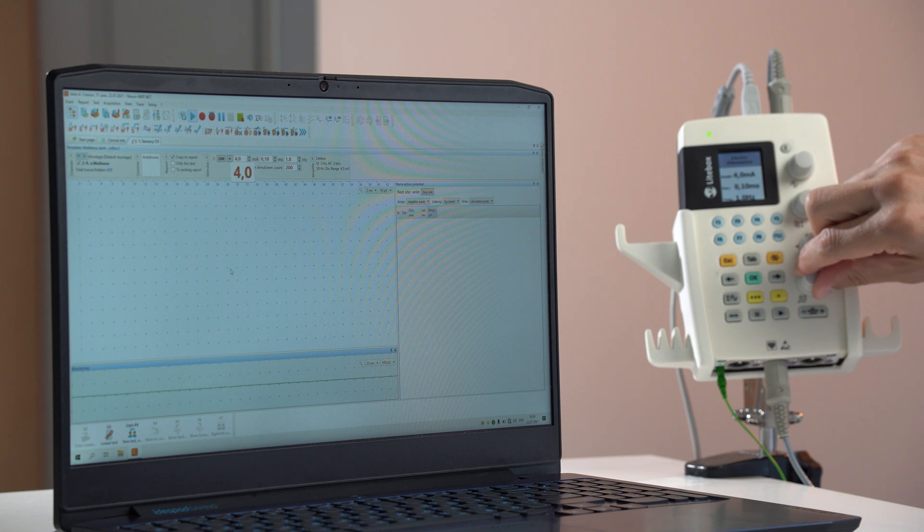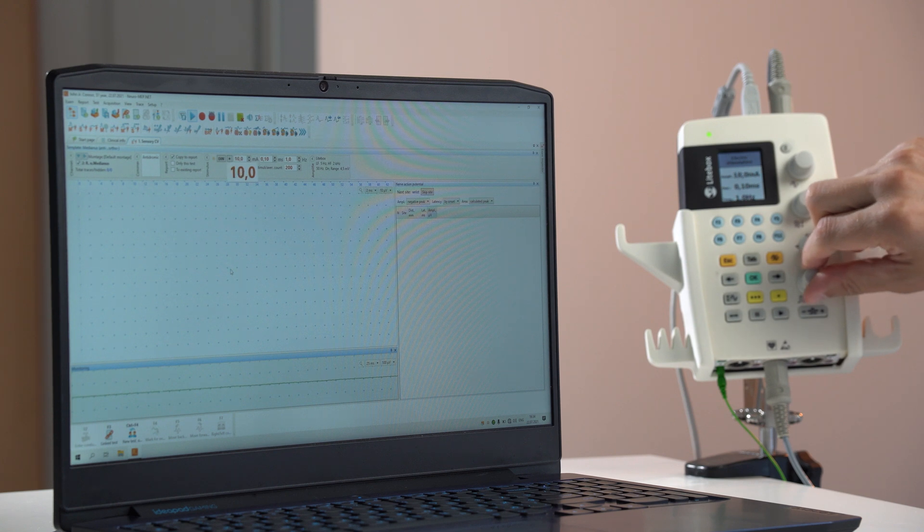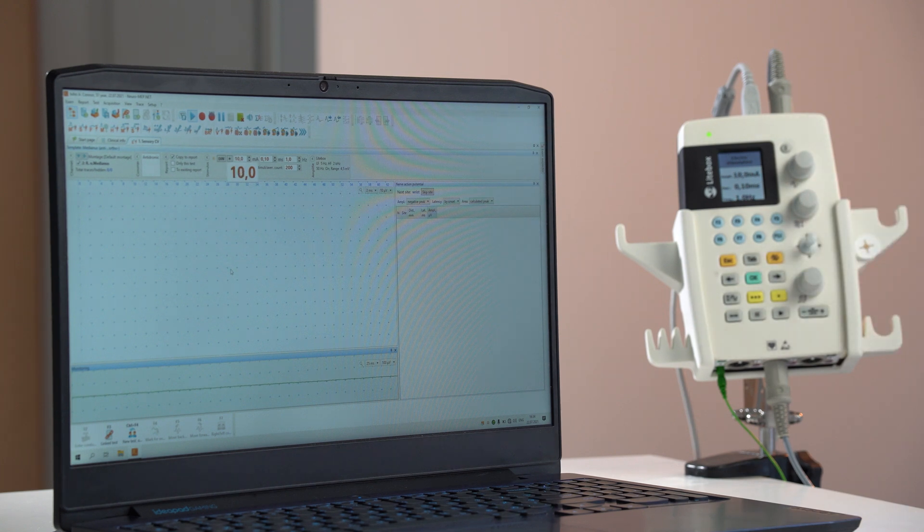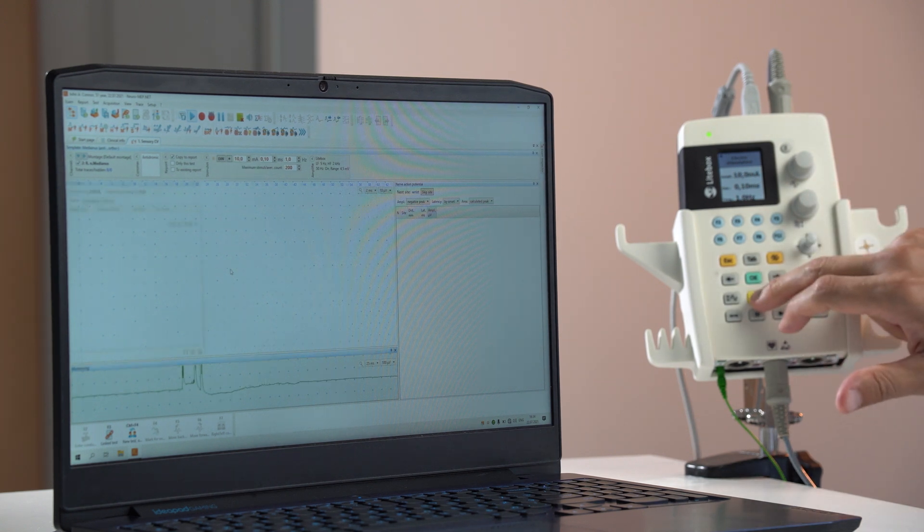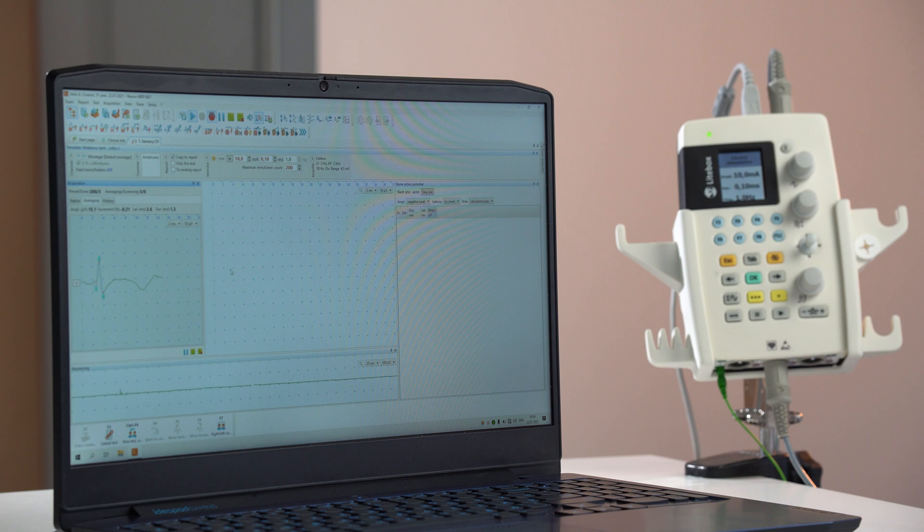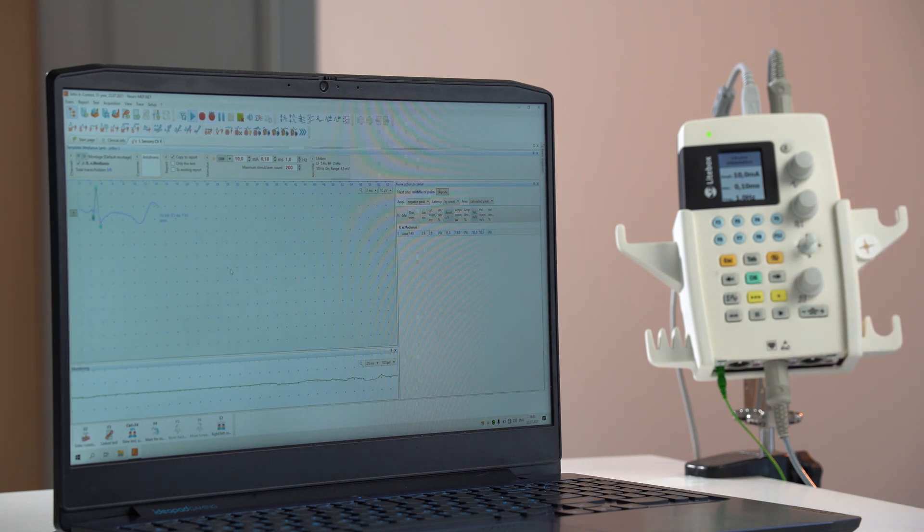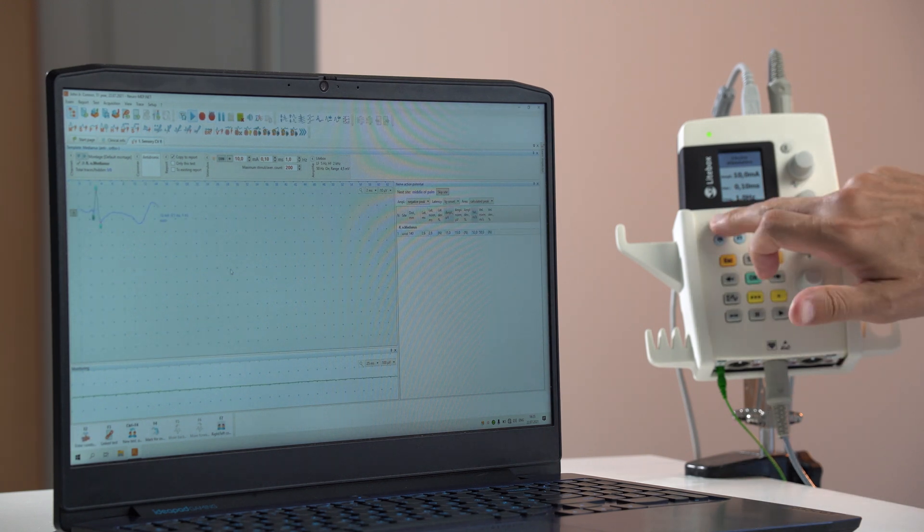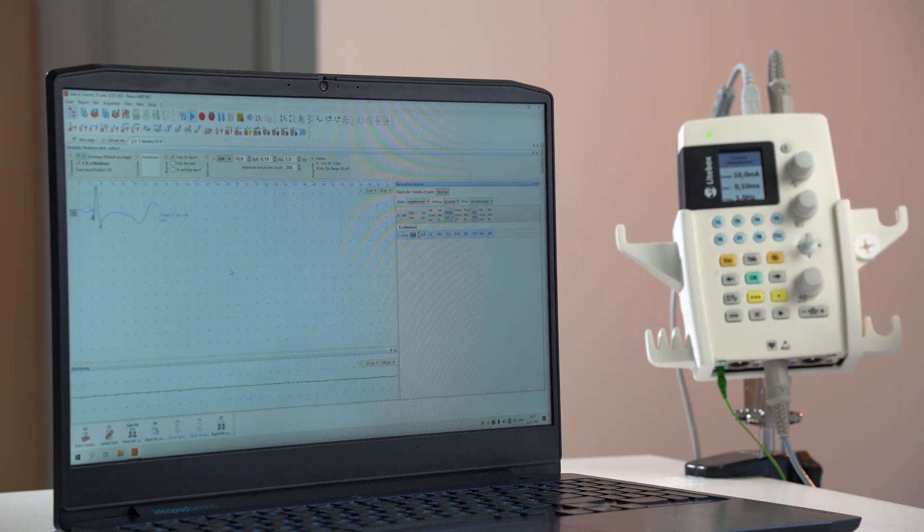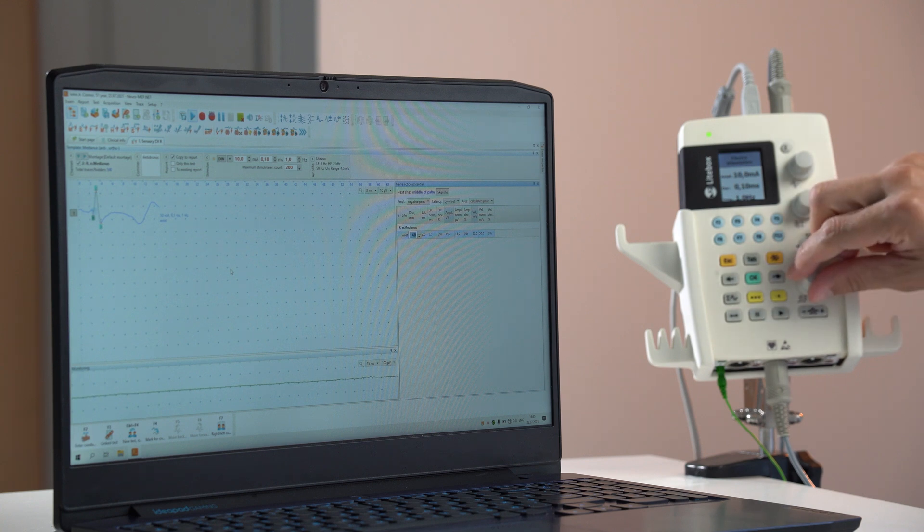The examination can be easily controlled with a dedicated keyboard on the Lightbox front panel. You can adjust current, start and stop stimulation, change operating mode and much more.